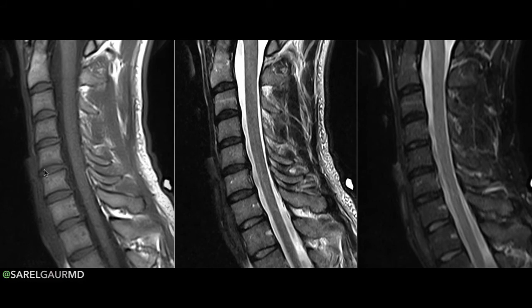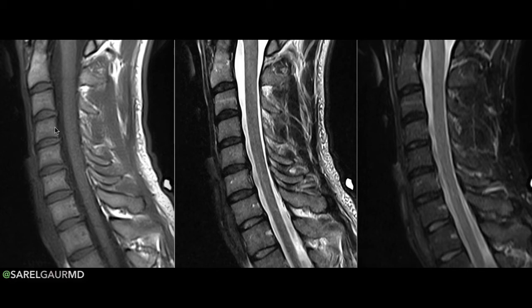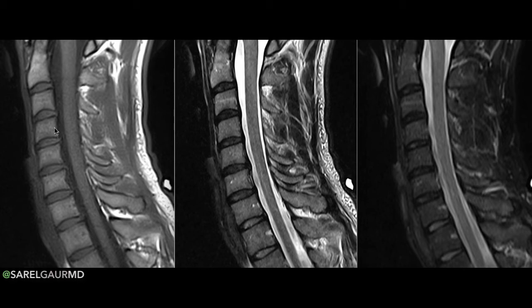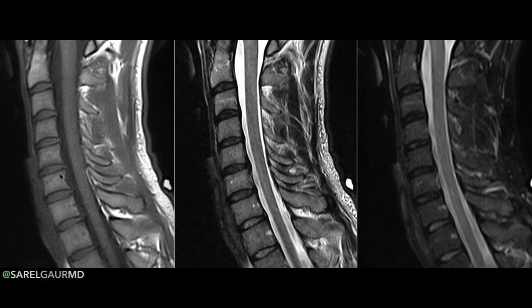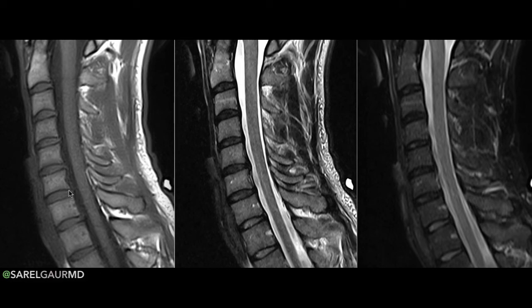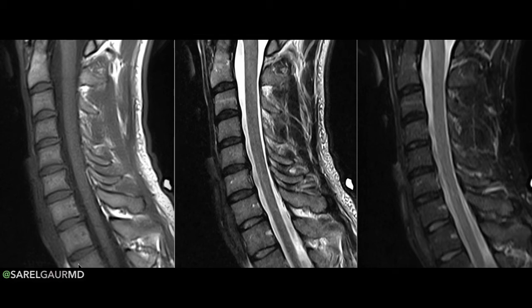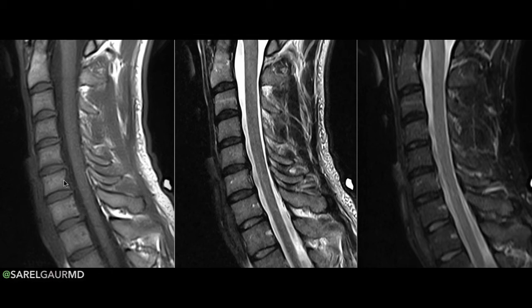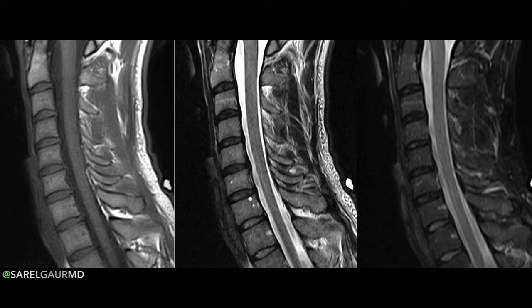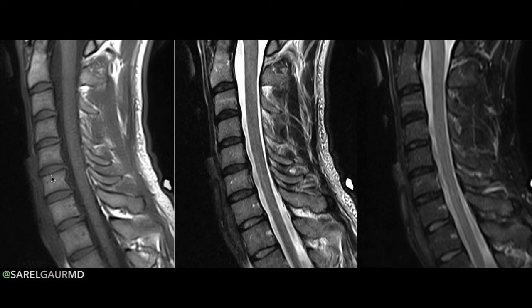The T1-weighted set of images tells me about any fat-based abnormality. The vertebral marrow has high signal relative to the disc because there is fat inside the vertebral body — cancellous bone full of fat and hematopoietic elements. If that signal is lost from any infiltrative process like tumor ingrowth or infection, I'll get a loss of that high T1-weighted signal, which I pick up really only on this set. If there is a diffuse hematologic process with proliferation of hematopoietic elements and the fat signal is lost, I'll see that here — not on T2-weighted or STIR — showing me abnormalities involving the vertebral marrow.